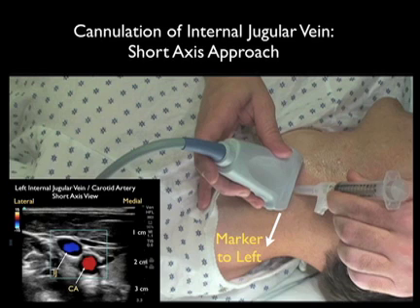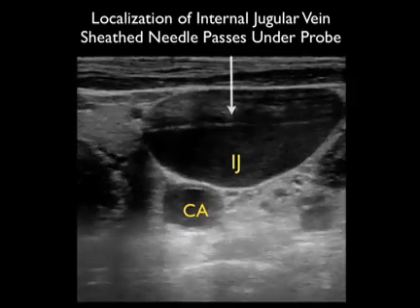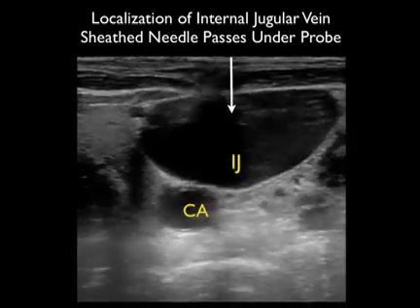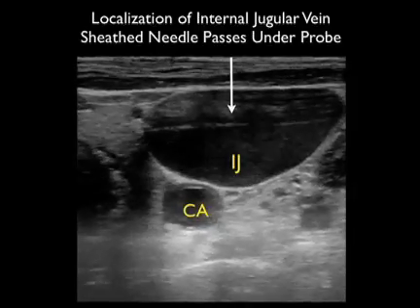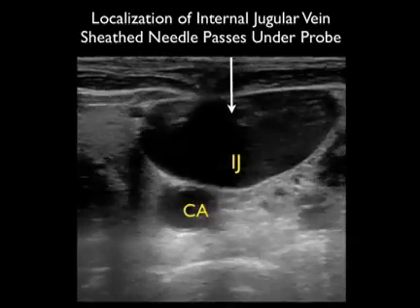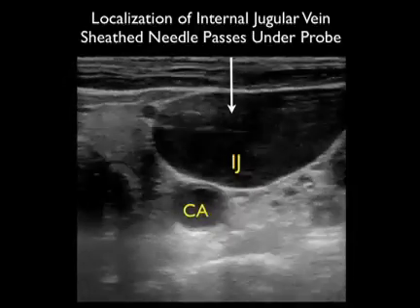The probe should be oriented in a side-to-side orientation with the marker down towards our left as we stand at the head of the bed, so it orients directly to the screen indicator dot which would be oriented towards the left of the ultrasound screen. Here we're localizing the internal jugular vein using this short axis configuration, coming in underneath the probe with the sheath needle at that 45 degree plane. Notice the ring-down artifact coming in directly on top of that internal jugular vein, telling us this is the correct puncture point.